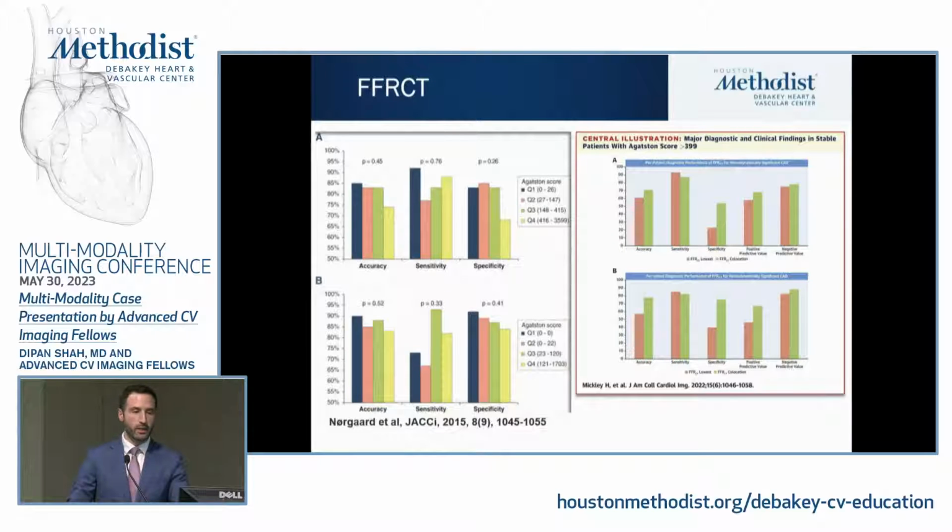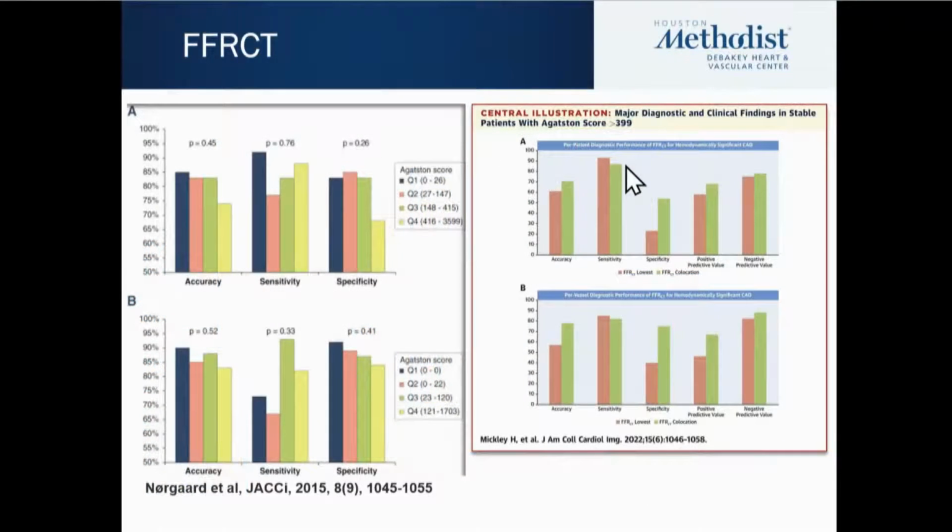These are two studies, NXT and FACC studies, where patients underwent coronary CTA with assessment of coronary calcification burden using the Agatston method, and they were then sent for invasive coronary assessment with FFR. So it's a wealth of data that allows us to do some nice correlation studies.